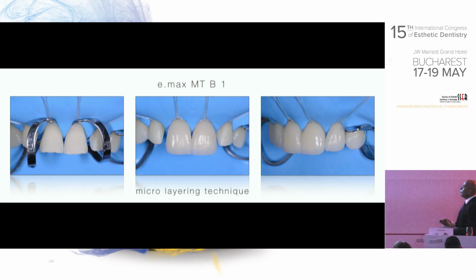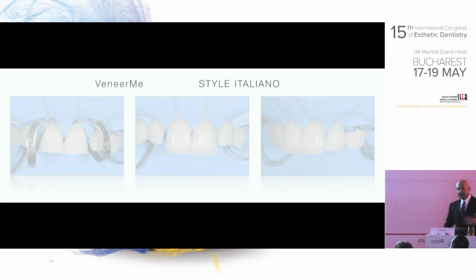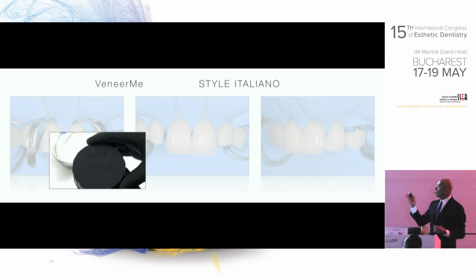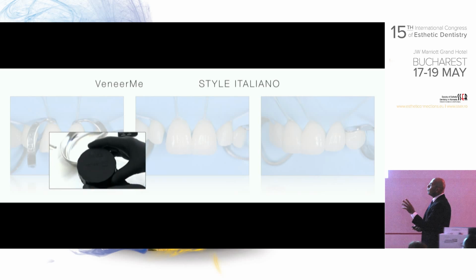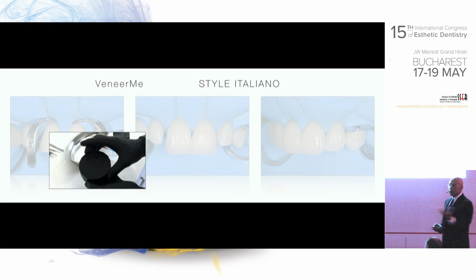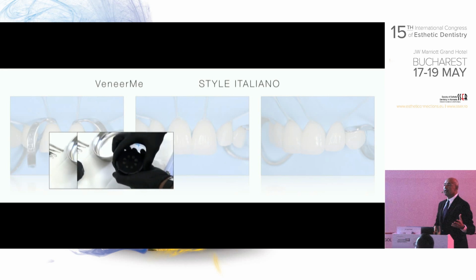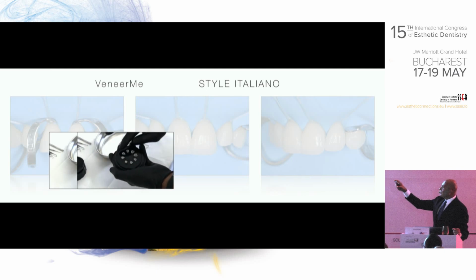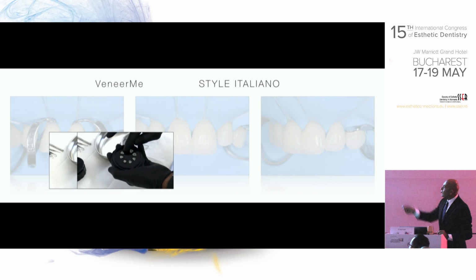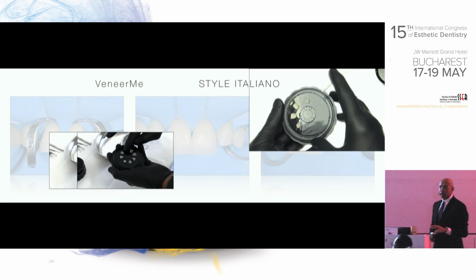So at this moment, we came out with another idea which became serious, and this Style Italiano created a project on this which is called Veneer Me. What I designed was a simple box that will help you receive the veneers from the lab and use it during your treatment of veneers. So when you open this, there's a mesh on top of this and a very, very sticky pad which won't allow the veneers fall down.